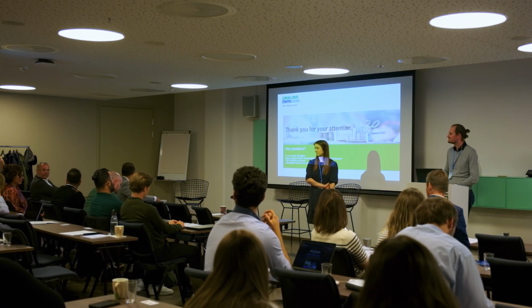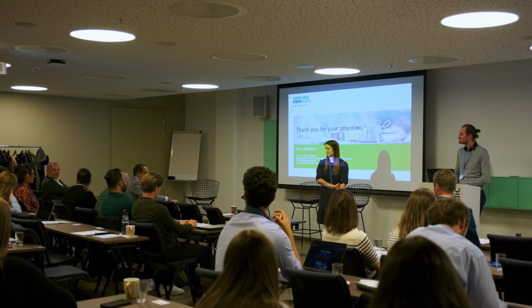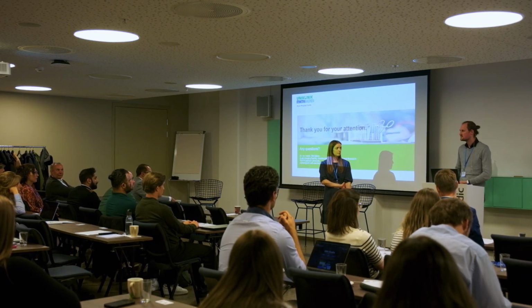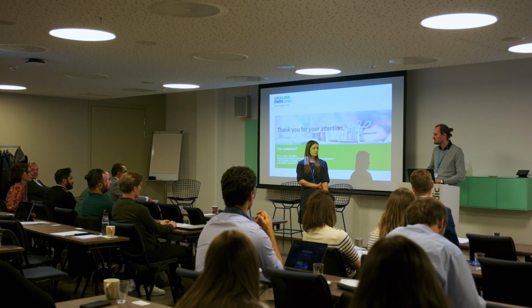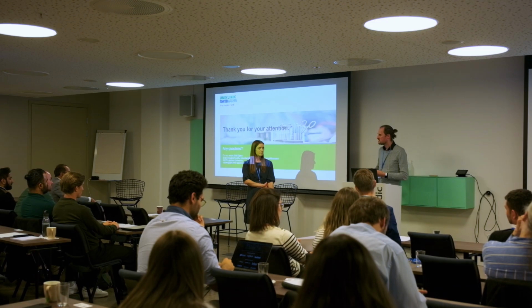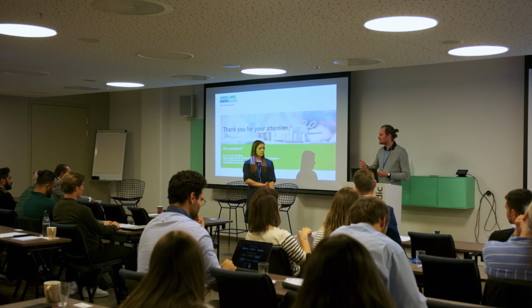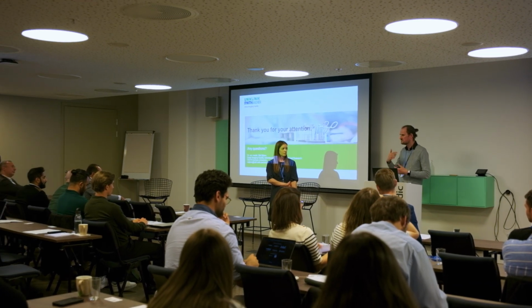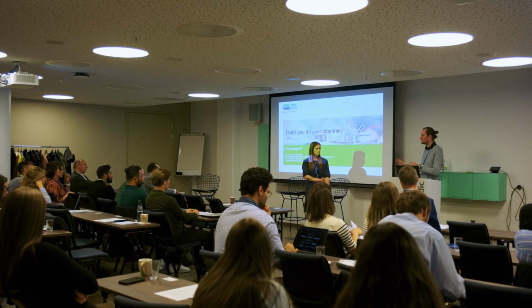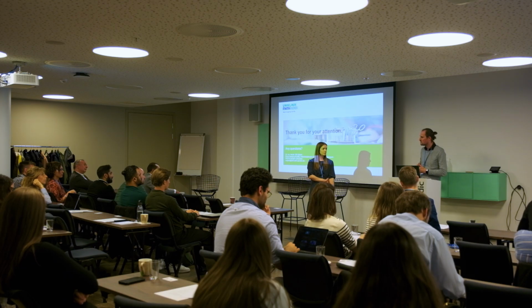Hey, thank you very much for the presentation. Maybe a big technical question, but did you think about a network communication between your 2 MRI setups for the MRI to communicate? We considered it. We weren't really sure how to set it up. So we know, as I mentioned, that we can trigger the scanner synchronization through, I think, BNC cable, actually. But then it relies on the trigger of one scanner to start the other. I'm not sure how it works with the network communication between the scanners directly.